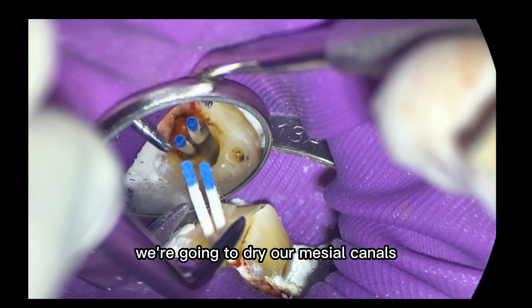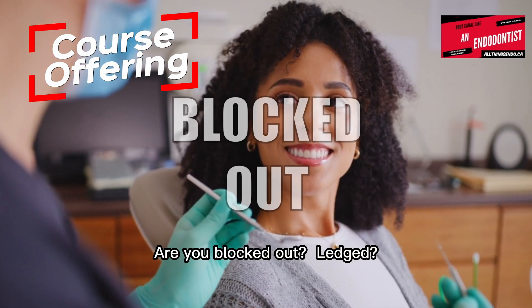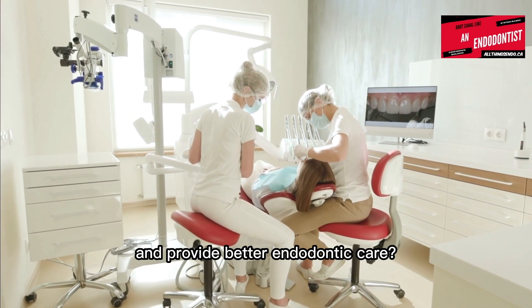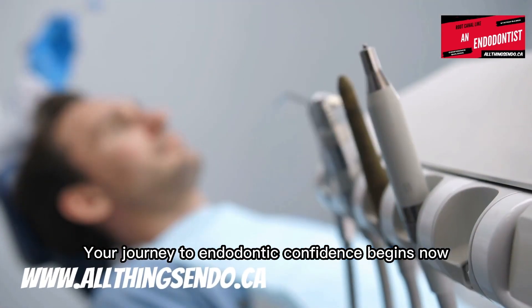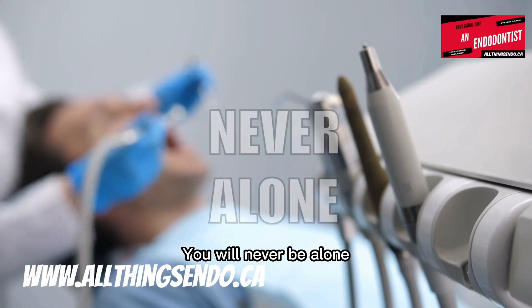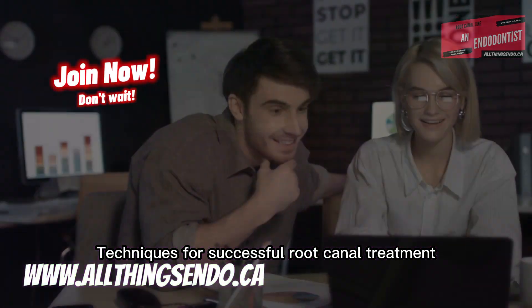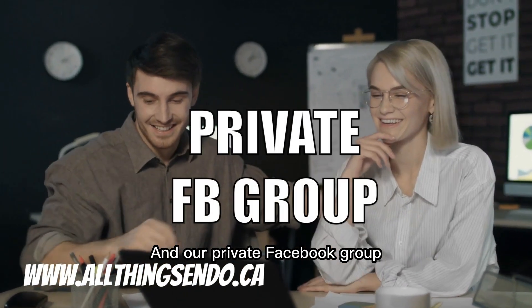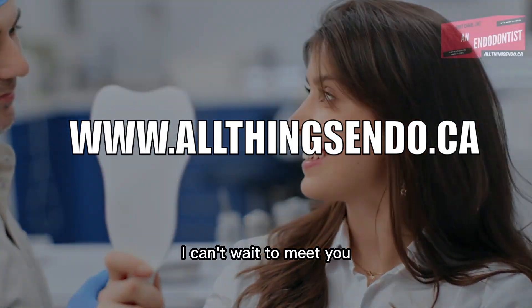So what we're going to do here is we're going to dry our mesial canals. Have you felt stuck during a root canal — can't get down a canal, blocked out, ledged? Are you ready to enhance your skills and provide better endodontic care? As a member of Root Canal Like an Endodontist, you will never be alone on the road to root canal success. Our online course teaches the most predictable techniques, with video lectures, interactive case studies, and a private Facebook group. Check us out at allthingsendo.ca.